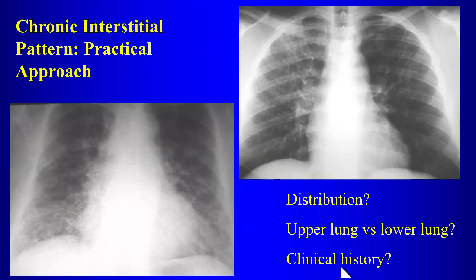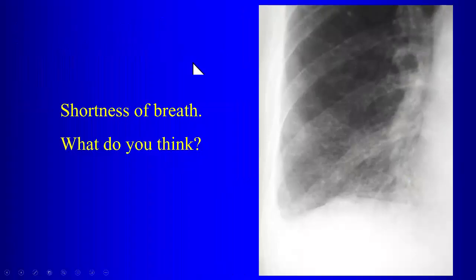The most important thing whenever you're discussing interstitial disease is the clinical history. So I would advise that you always look in the chart to see what history you can get. And as we proceed, you'll see why that can be important in terms of formulating your differential diagnosis.